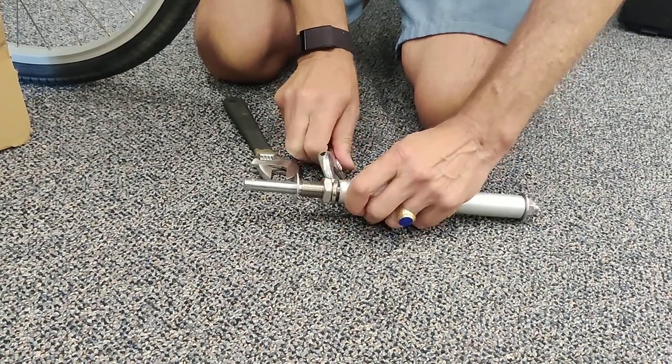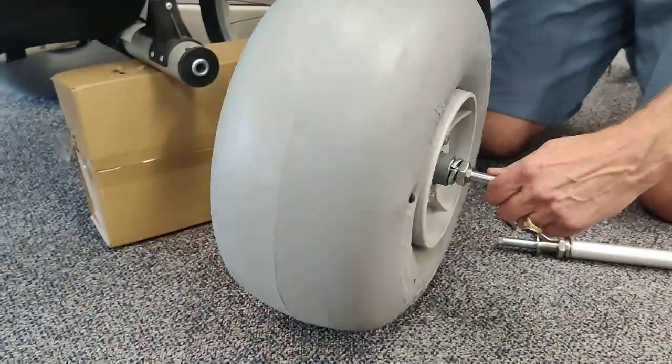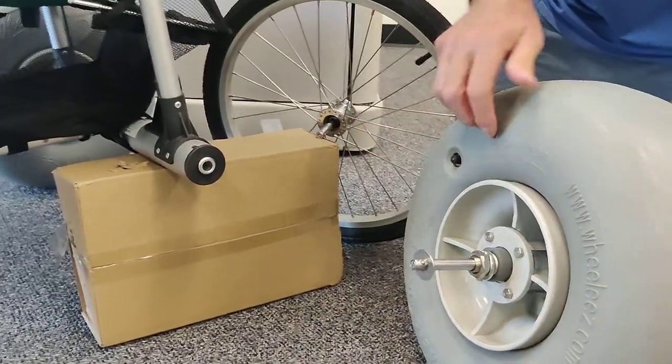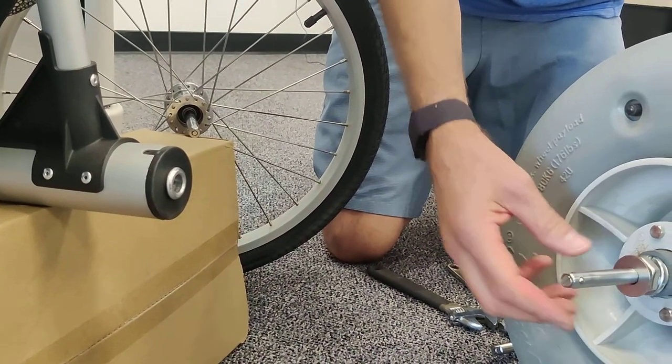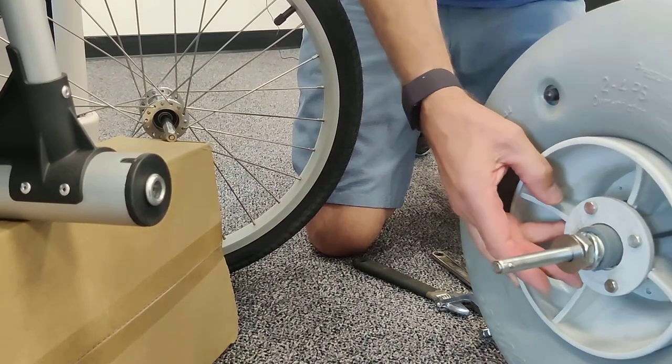I've already inserted a quick release axle into one of our 42cm wheels, and it's going to be ready to put onto this Coolstride stroller. This washer here is to keep the socket from touching the threaded section.